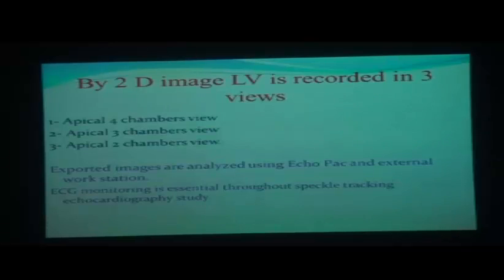By 2D imaging of the left ventricle, it is recorded in three views: apical 4-chamber, apical 3-chamber, and apical 2-chamber. Exported images are analyzed using EchoPAC on an external workstation. ECG monitoring is essential throughout the speckle tracking study.